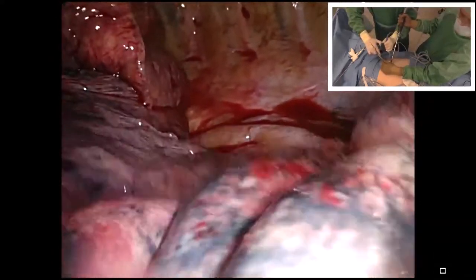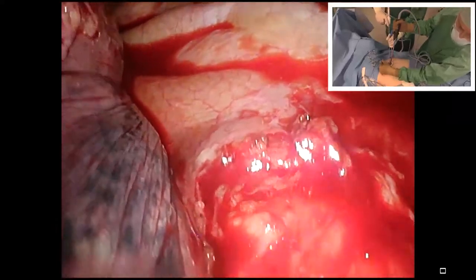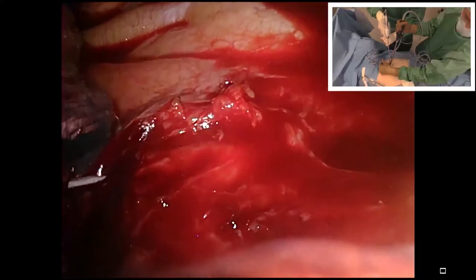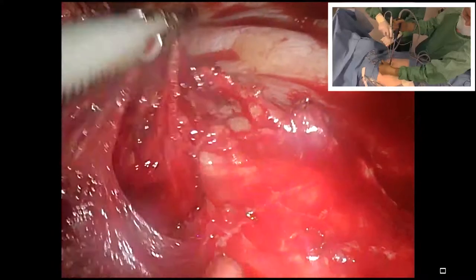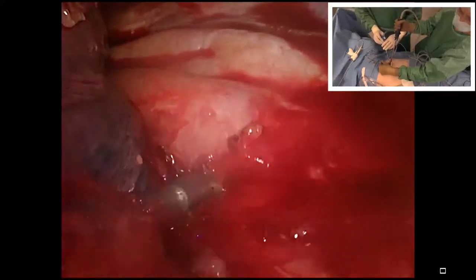Well, Diego, do you suppose to start from subcarinal dissection maybe now? No, it gives you more freedom for bronchoplasty. I want to check, because you almost create, look, the tunnel, Vadim. Yes, I see. I think we can manage it also in this way. I think, Vadim, it was not the question from which way to go, but to take position 7 now. But the lobe is very emphysematous. I think we will do it later. That's my proposal.